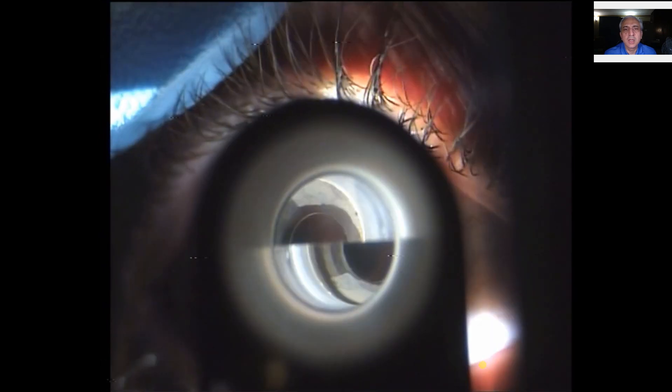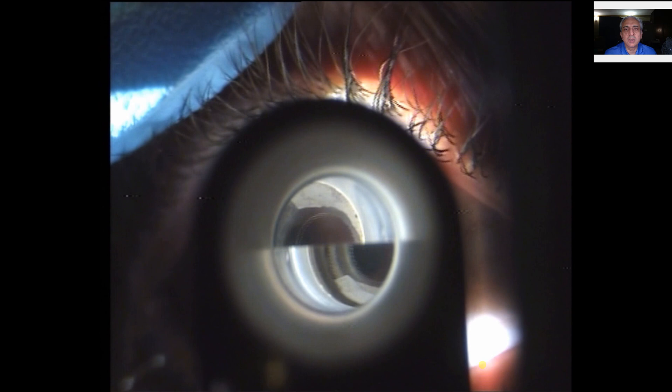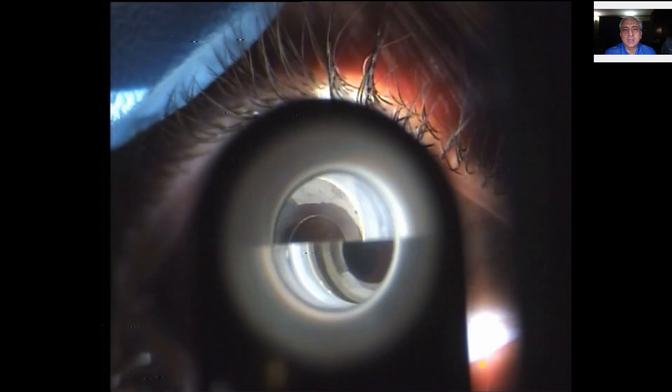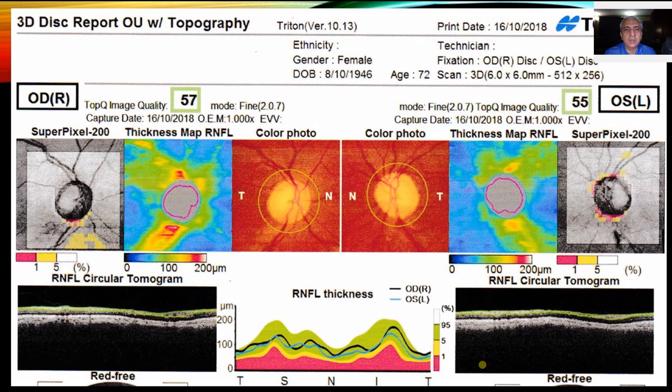I'm going to do tonometry without using fluorescein dye, for which you need to add 2 mmHg to the reading. Here you can see the mires are slightly under, so you rotate the dial on the scale to increase the pressure. Here the mires are just sitting slightly more than inside. Typically it should be inside-to-inside on the Goldmann tonometer when you're doing it with fluorescein.